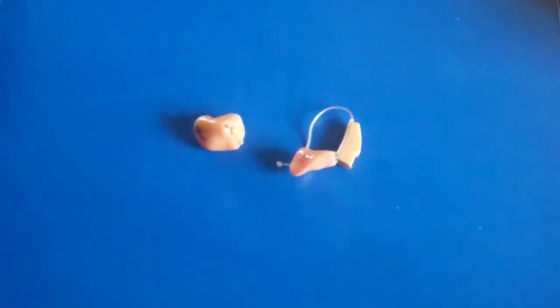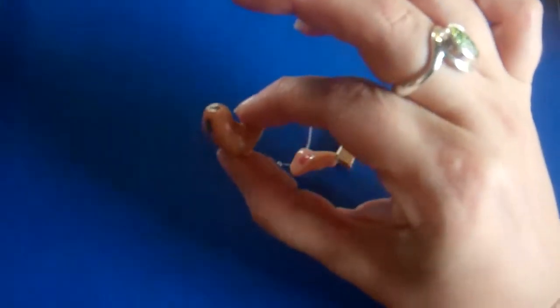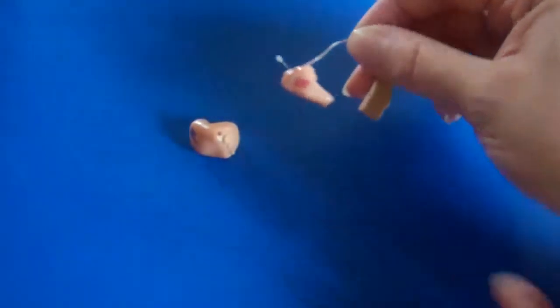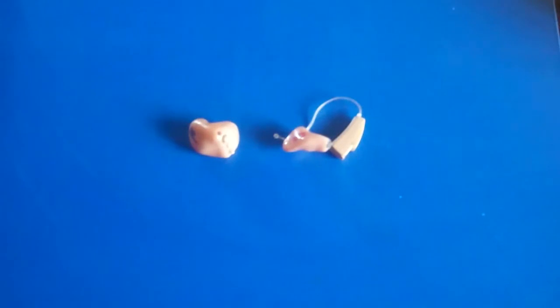This video is going to discuss how to clean your custom hearing aid. We're going to be looking at a traditionally custom hearing aid that fits in the ear all on its own, and a receiver in the canal hearing aid with a custom tip on the base. The cleaning instructions are the same for both, with one minor difference.